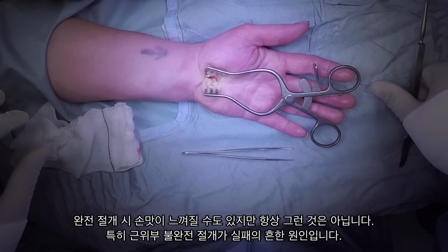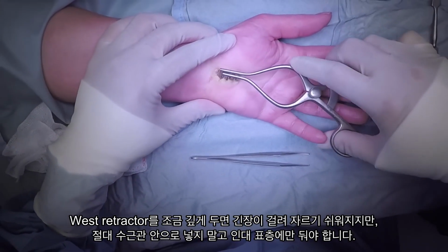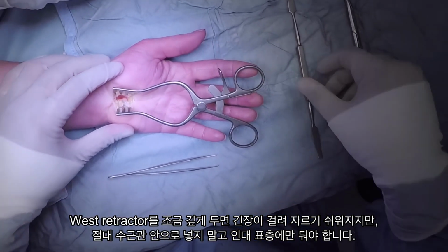You might find that resighting your West retractor a little bit deeper improves your vision, but also puts the ligament under a bit of tension, making it easier to cut, or at the very least feel if it's still in continuity. It's important that you don't put the retractor into the carpal tunnel itself, so make sure that the teeth are superficial to the transverse carpal ligament to avoid any injury to the contents of the carpal tunnel.